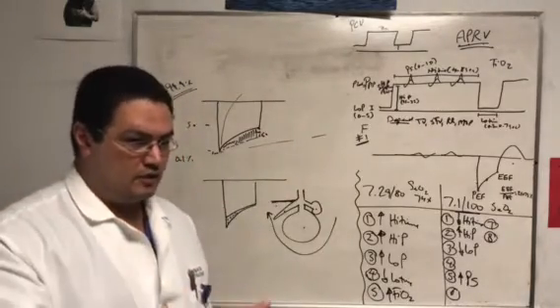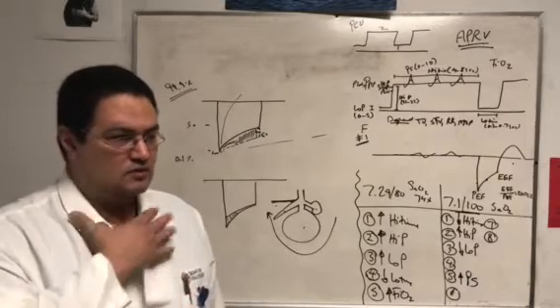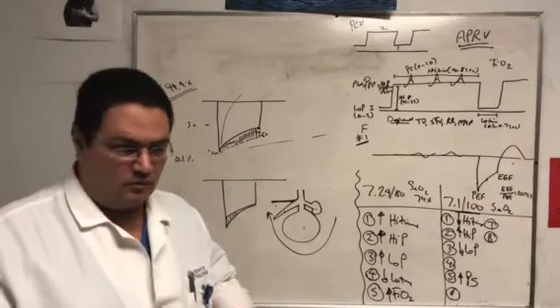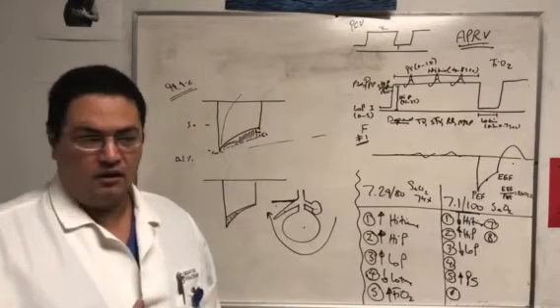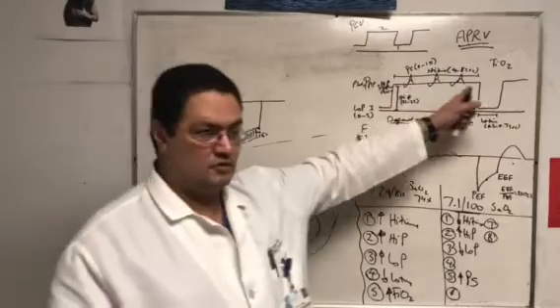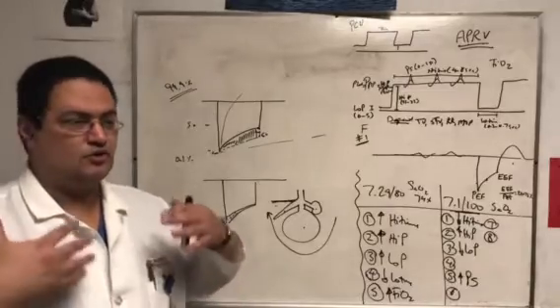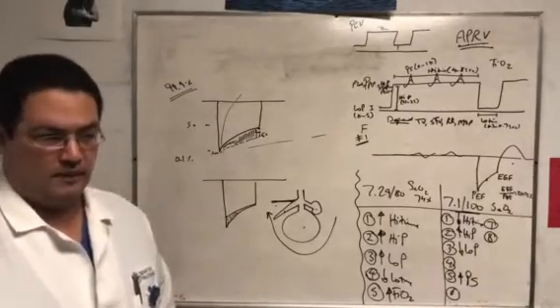And when there's a positive pressure going into the lung, it goes in a path of least resistance, so it over-inflates these alveoli, and under-inflates West zone number 3, which will be the least inflated. So it exaggerates the pre-existing VQ mismatch. This mode of ventilation, because there's a lot of spontaneous breathing here, will allow improvement in VQ matching, right? Because the negative pressure breath is much better distributed throughout the lung, right?